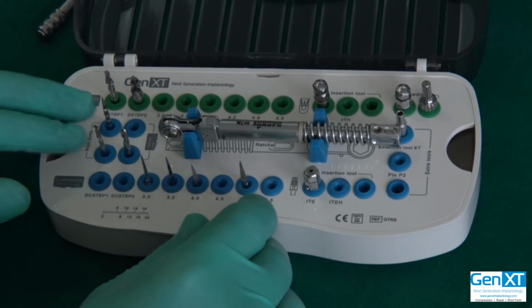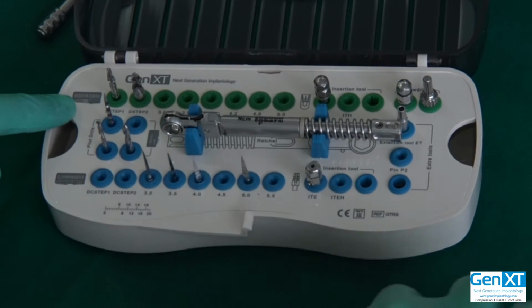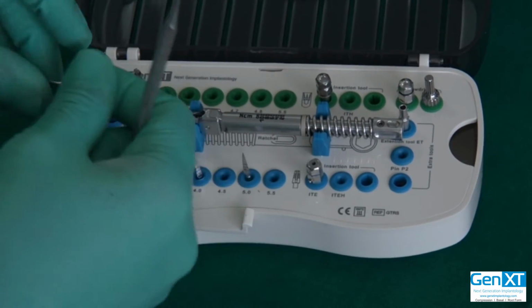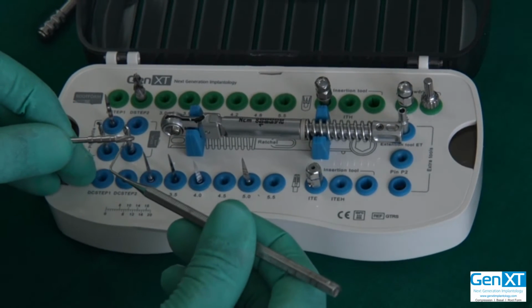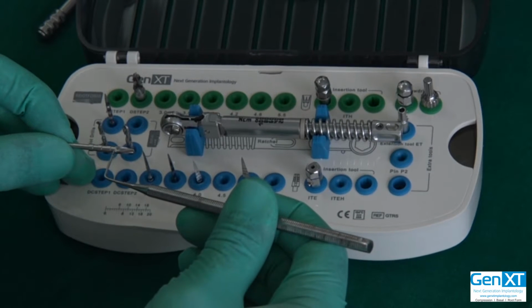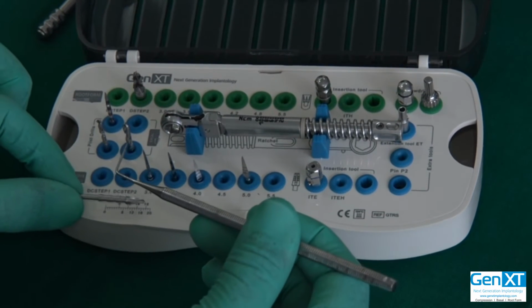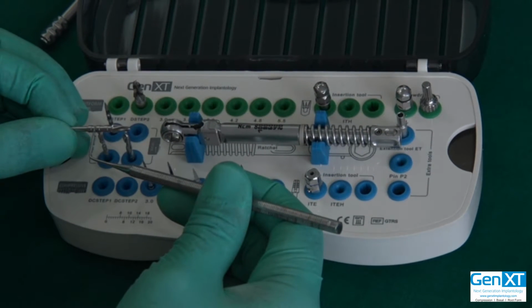Once you do these 2 drills, then you go to the form drill for the root form. See, you have root form mentioned over here. The form drill has got the basic external body shape of the root form, and then again it is graduated from 8, 10, 12, 14 over here. You can always check the measurement over here on the box. This you will do up to the desired depth.